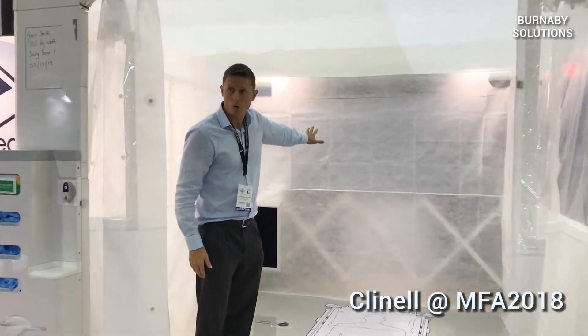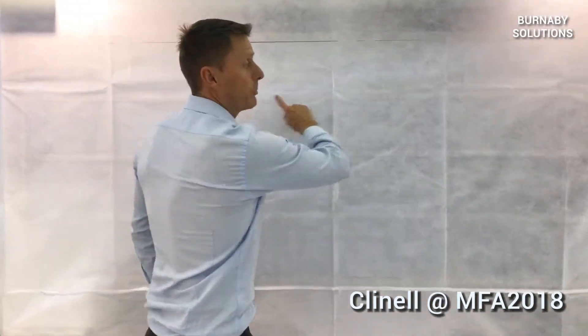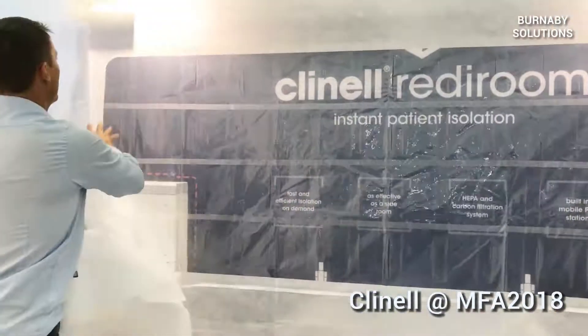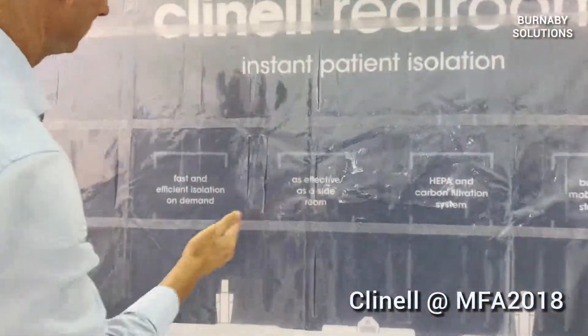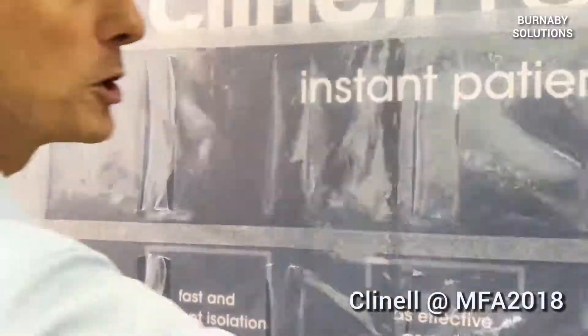On the back wall, if you need to access services on the back wall, there is a privacy screen here that we're going to remove. And we have a double perforated wall where we can access oxygen, suction, anything we need at most positions.